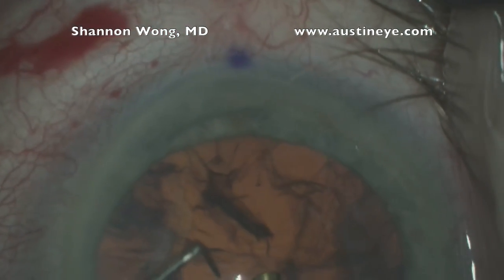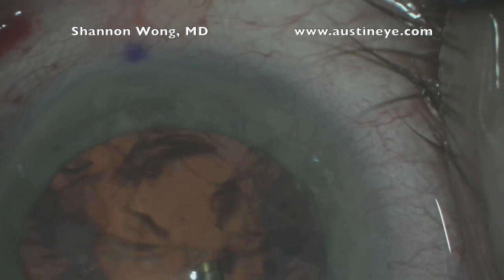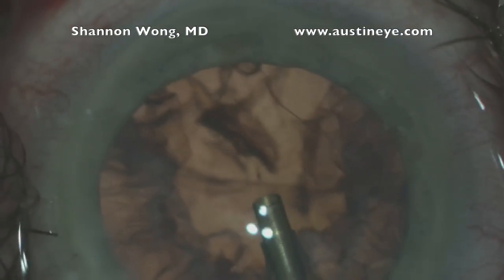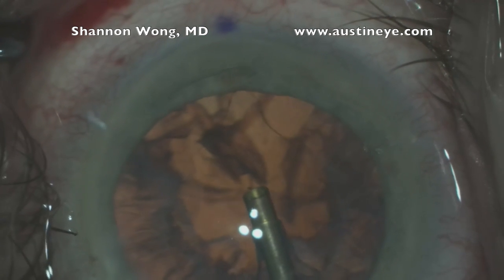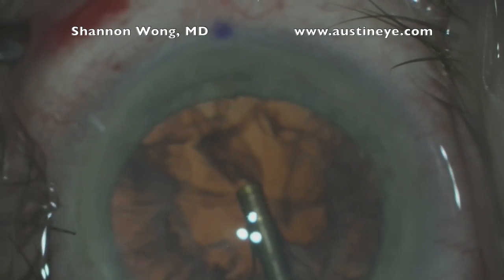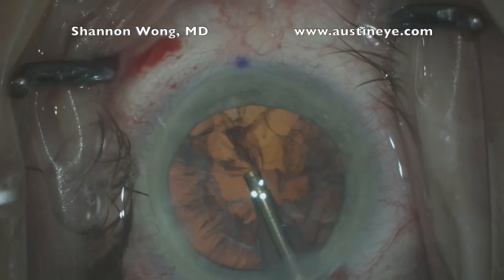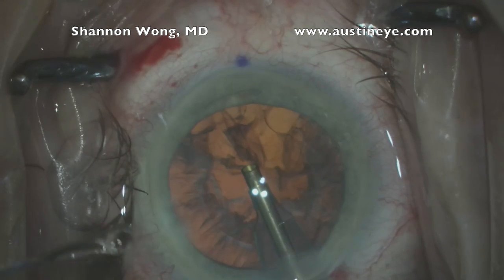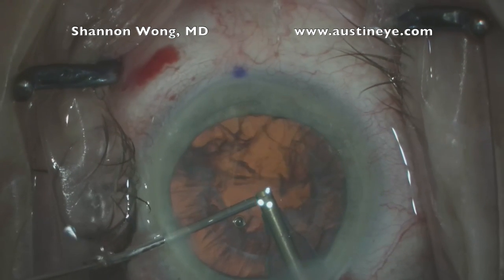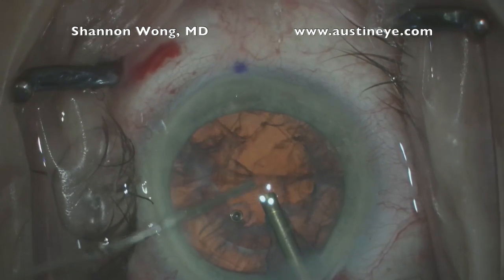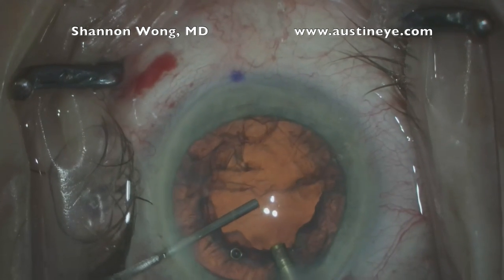We can see it right there at 12 o'clock — looks like a little upside-down V. In order to put as little stress on the anterior capsule as possible, we don't want the anterior chamber collapsing, so we use viscoelastic to fill the anterior chamber such that as we remove our various phacoemulsification and irrigation and aspiration handpieces, the capsular bag never collapses.